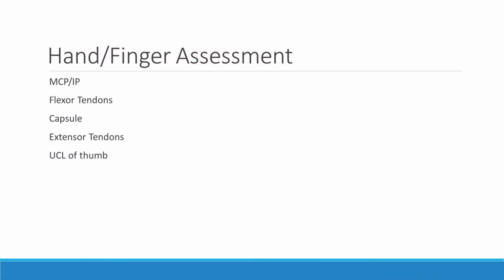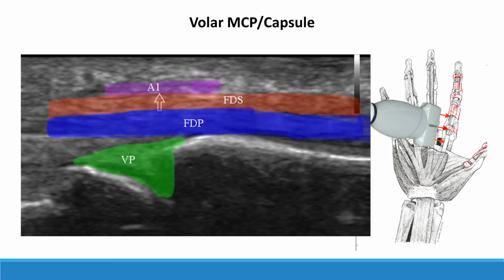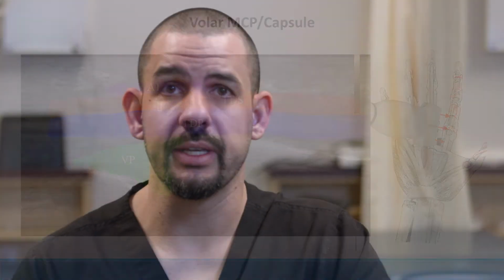We will also look at, both volar and dorsally, metacarpophalangeal joints, interphalangeal joints, and distal interphalangeal joints, typically looking for erosive changes, health of the tendon gliding, and that sort of thing.